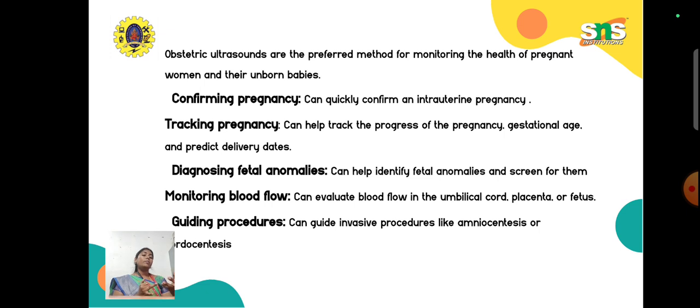It helps in following how the pregnancy progresses through the different gestational stages, from stage 1 to stage 4, till delivery of the baby.